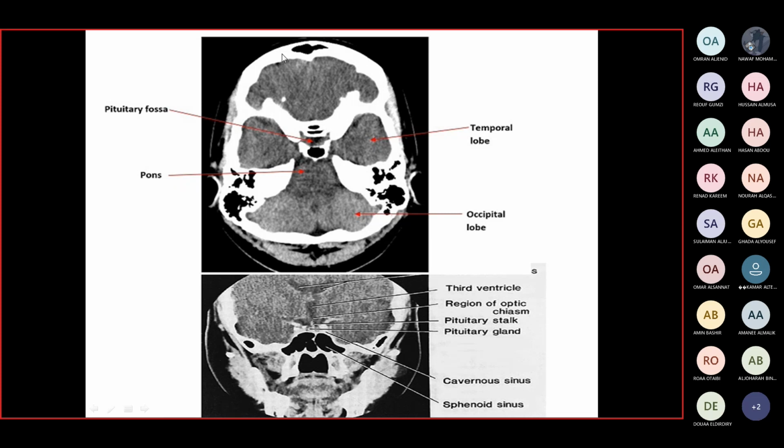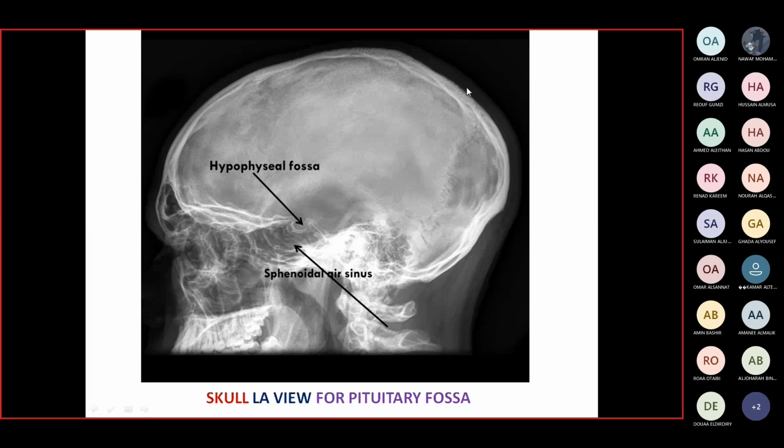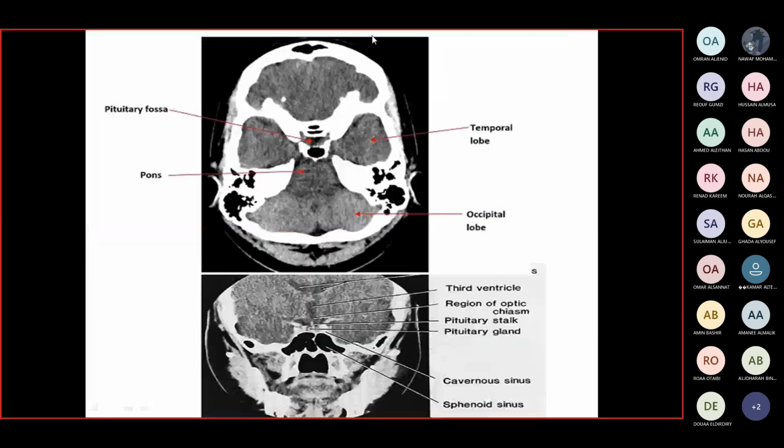As you know, to differentiate between the CT and MRI, in CT the bone is very dense. In X-ray also, as it uses X radiation, the bone is dense, but it's less dense than in CT, because both techniques use X-ray.